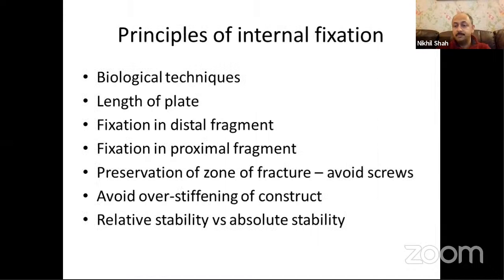So then what is important to understand is the principles of internal fixation. We all started off as trauma surgeons, but somewhere along the line, some of these principles get forgotten. And Sanchit showed a very nice case of a long plate. And I completely concur with that. So these are the questions that I tend to ask myself or teach the fellows when they're going to do a fixation of this type.